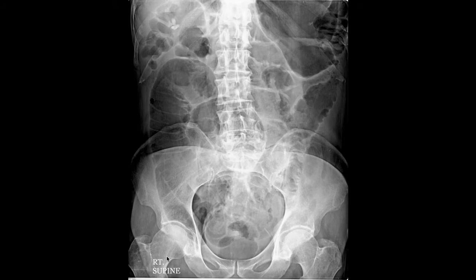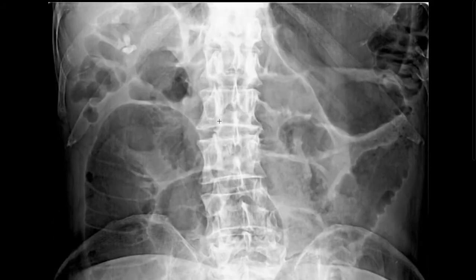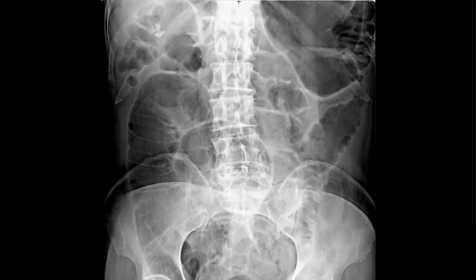This is labeled well. This is the right side, and in the supine position. The position also has to be labeled. Okay, so let's identify some anatomy here. There's the spine. It's centered. We see the patient has some deviation of the spine. This can be due to 2 reasons.